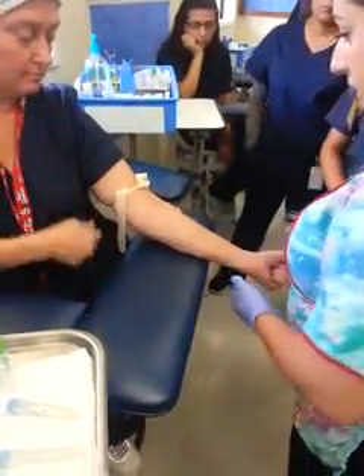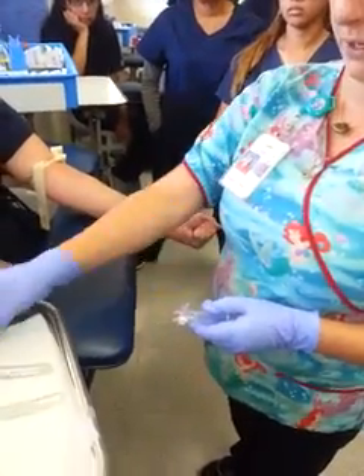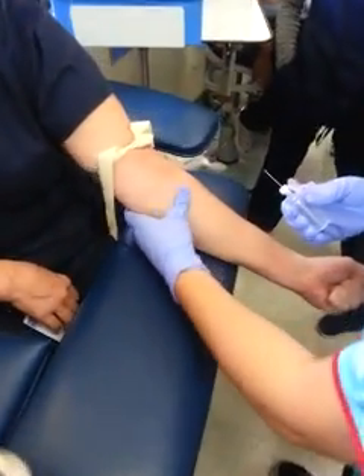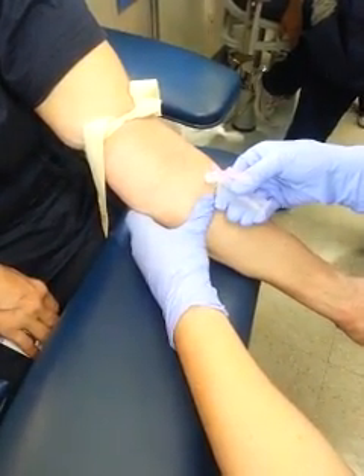Ask the patient to clench their fist. Remove the needle cap away from you and away from the patient, making sure that your bevel is up. Anchor with your thumb — not too close, far enough — and insert, gliding the needle in easily.